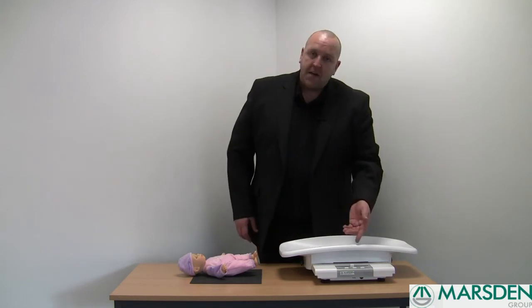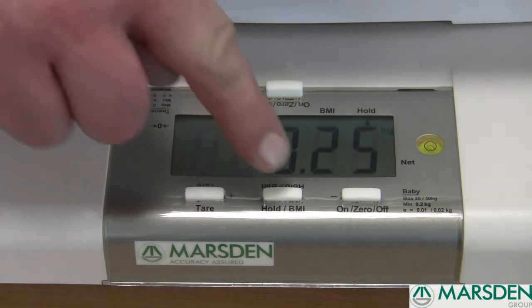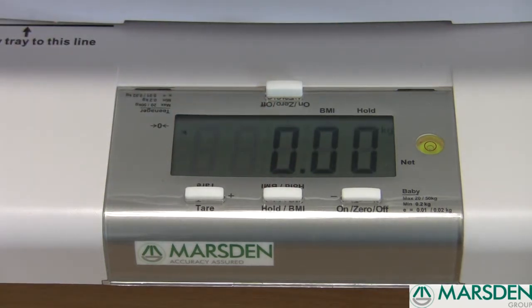The weight remains on the indicator to enable you to take a note of it, and once you have done so, press the hold button again. The scale goes back to zero, ready for your next patient.